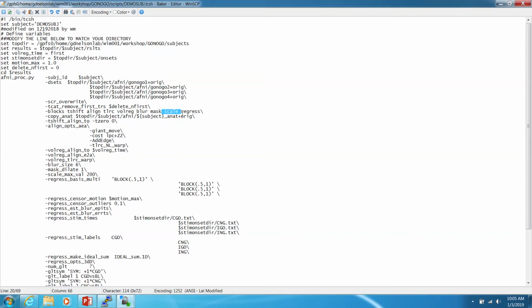Then it takes distance in signal from that 100 point, and that ends up making each of these have the same mean starting point. So then when they all have the same mean value, they can be combined sensibly together. So it combines all of these after it's scaled.